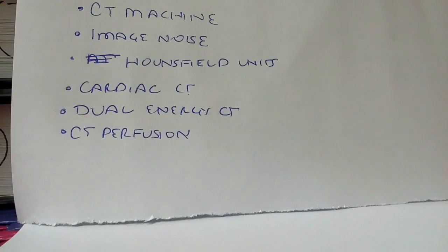Also, what do we mean by CT perfusion studies? CT perfusion study is basically to find out the blood volume, the rate of blood flow, and the tissue perfusion of the contrast agent. Contrast agent is injected, and multiple CT scans are taken over a period of time to see the movement of the contrast, and through this we can understand how the contrast is interacting with the tissues, and that can help to make an image.